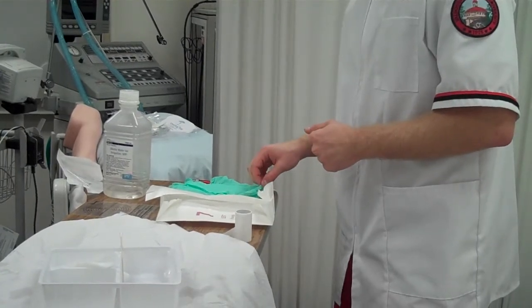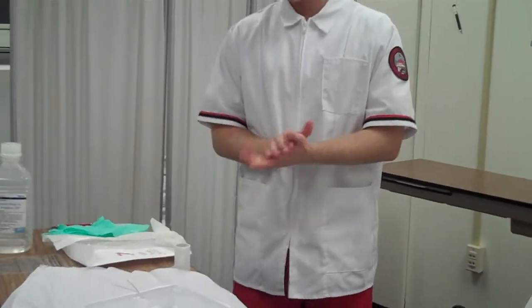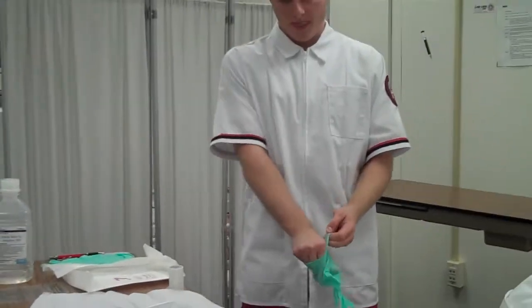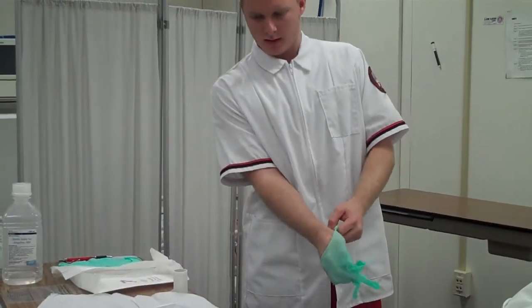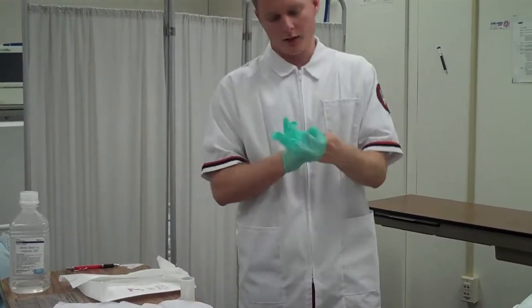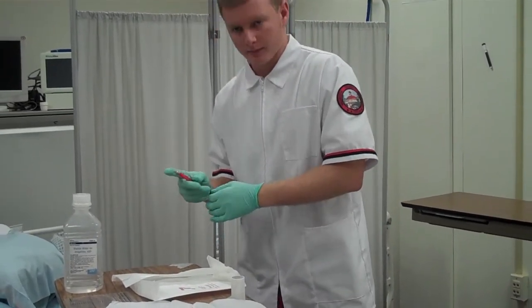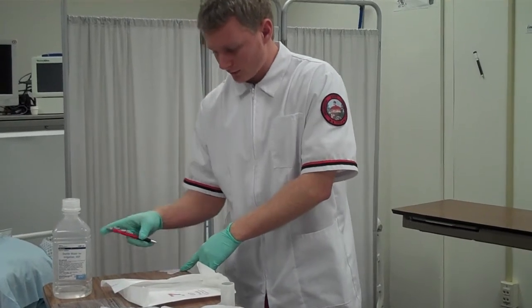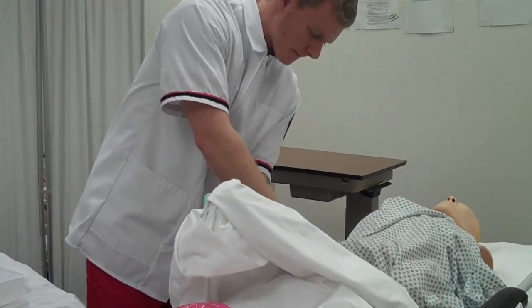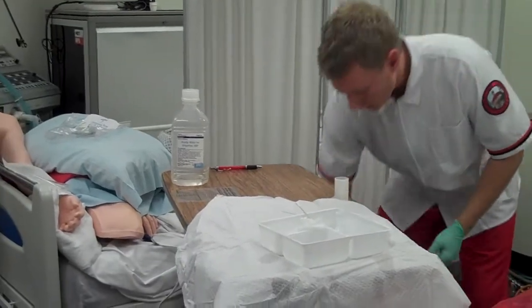I'm going to put clean gloves on, wash my hands, put clean gloves on. And also, I would write the time, date, and my initials, and put that on the wound. And now I can throw my trash away.